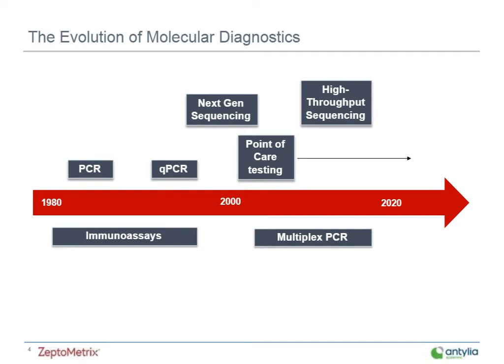And I think all of that leads us to today, where we're at the point that it's possible to characterize a new virus, in the case of SARS-CoV-2, sequence it, and develop point-of-care tests in a matter of months, which is kind of incredible. Obviously, brand new discoveries are being made more and more often, and what we're seeing now is that the time is shrinking in between each new innovation. So really now the race is to further increase sensitivity and specificity always, to cut costs, make it more affordable, to make these point-of-care instruments especially smaller, decrease their footprints, make them easier to use, and the top priority being to decrease the time it takes to get a result, to go from a patient sample to a diagnosis.